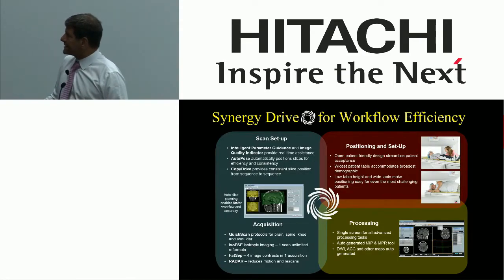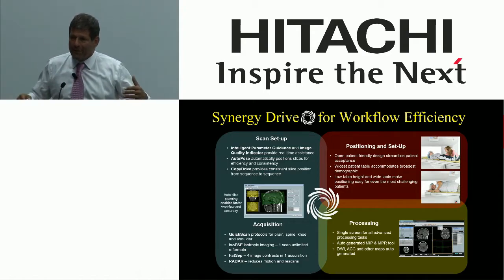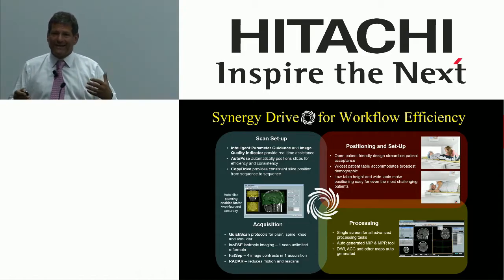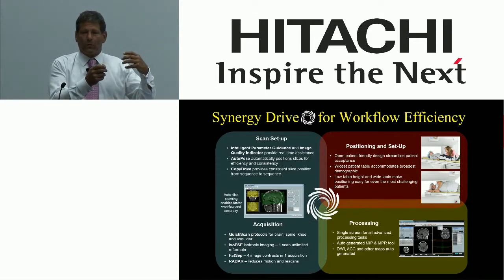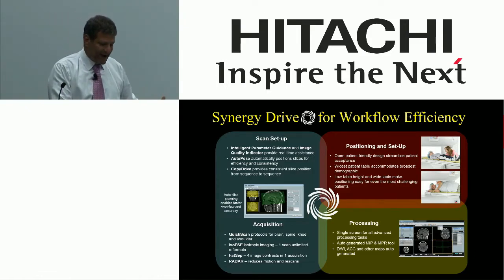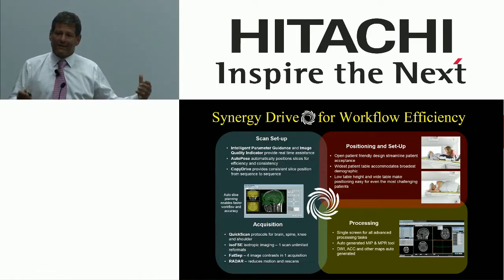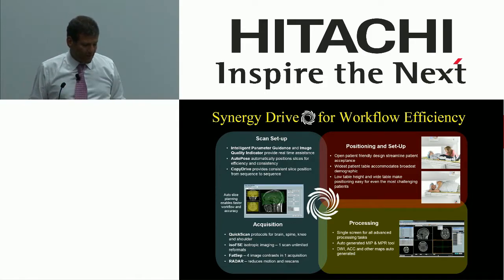Unfortunately, and this is a slide from the Hitachi promotional material, the manufacturers are focusing on these issues. They're focusing on the fact that we can't be wasting time in preambles. We can't be wasting time trying to find the anatomy. We can't be wasting time trying to set up exams because it doesn't contribute to patient care and it gives us a less patient-focused examination.